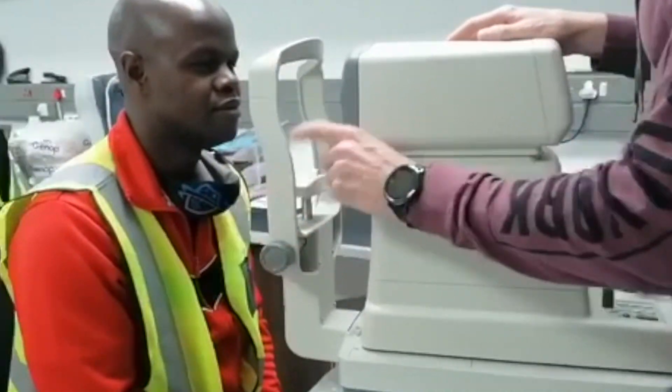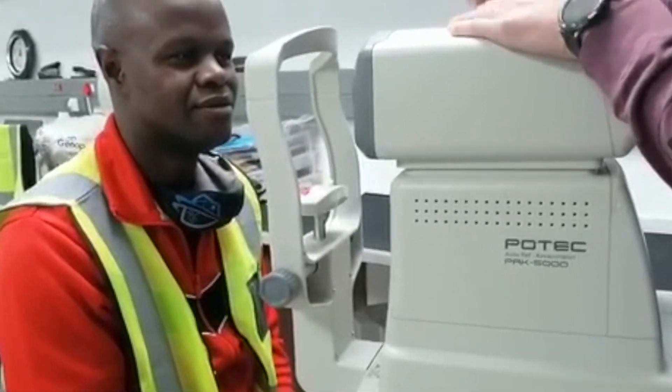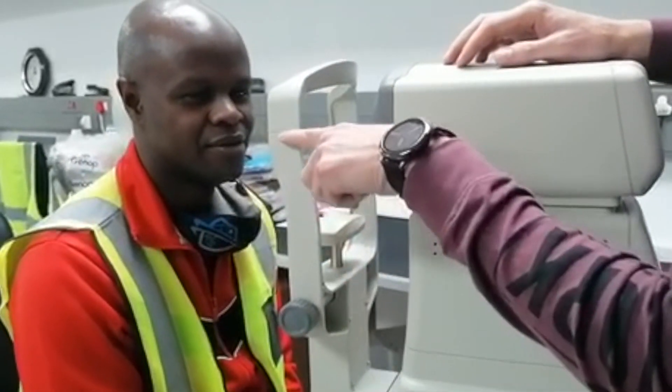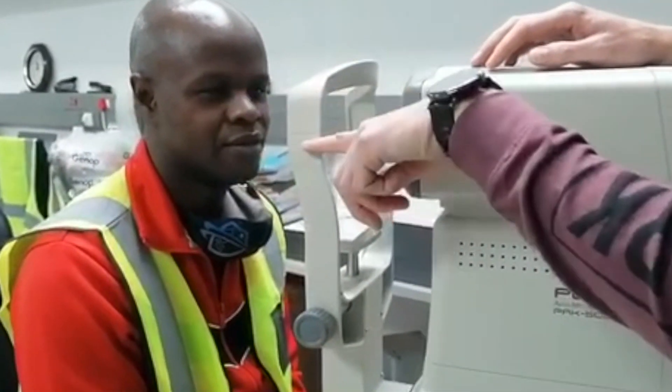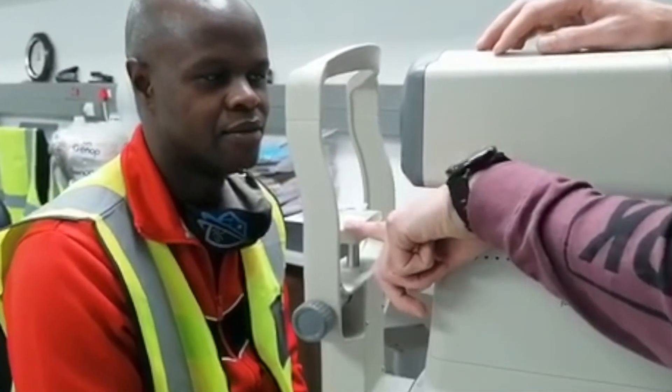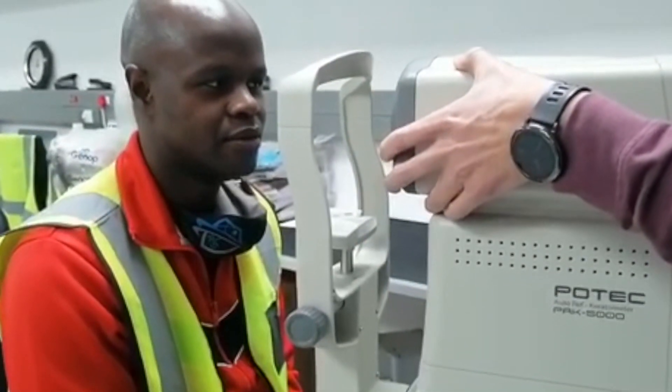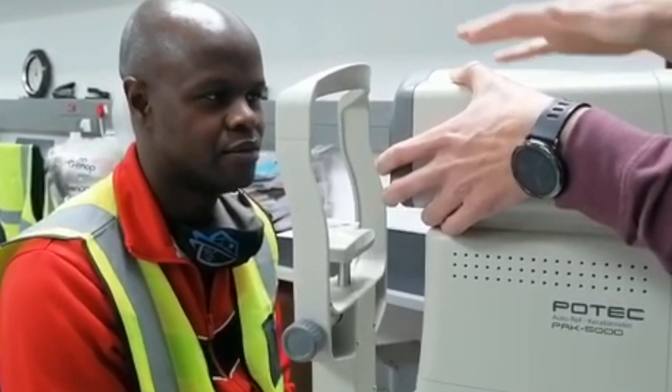Now we're going to line up a patient. Elias over here, he's volunteered. So first you'll see a line over here, I will have to line up with that in the chin rest cup over here so you can look inside. He'll see a hot air balloon on his side.